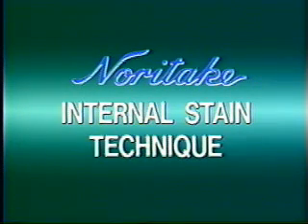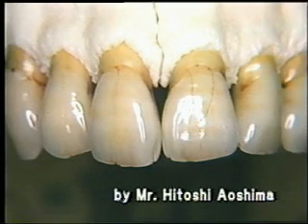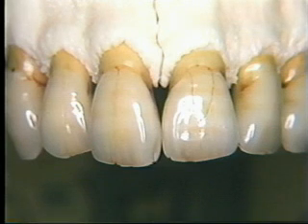From observation of the natural tooth, it can be understood that the color shade varies in different areas. The internal stain technique attributes strongly to reflect these complicated patterns naturally. This internal stain technique was first developed by Mr. Aoshima in 1986.